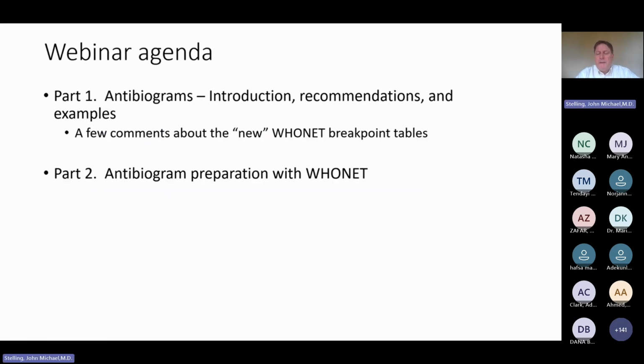I originally was planning this webinar to focus on two things, antibiograms and the new WHONET breakpoint tables, and I will cover both to some degree. I gave a version of this webinar approximately a week ago to the country Laos, and we filled two hours with the antibiogram, so I will talk to some degree about the new WHONET breakpoints, but to make sure we finish everything on time, the focus will be on antibiograms, with a few comments on the new breakpoint tables.